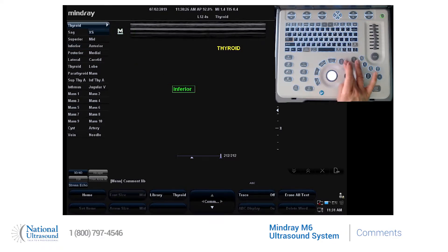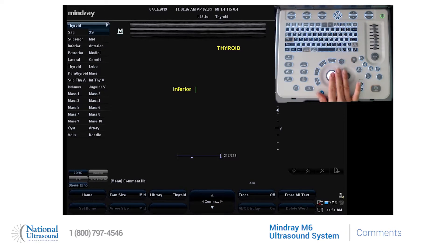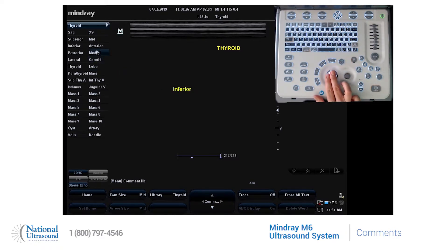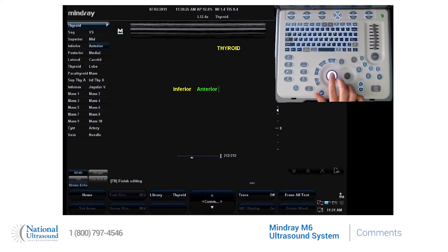And again, to move it, it's with your set and your trackball. You can also use the trackball to simply scroll to the term and press your set button to enter it on the screen.